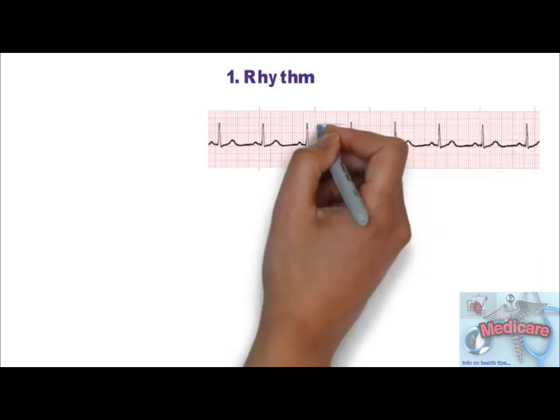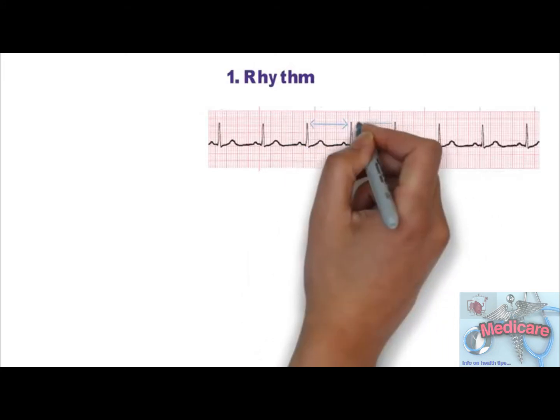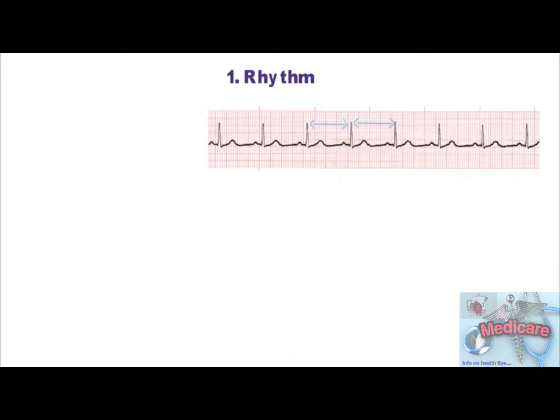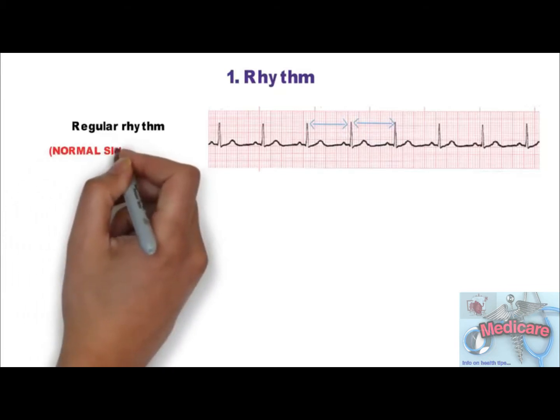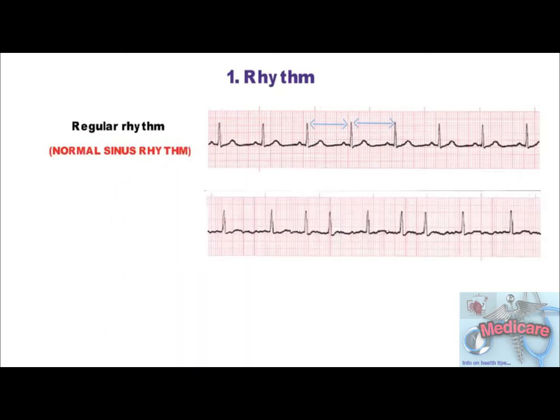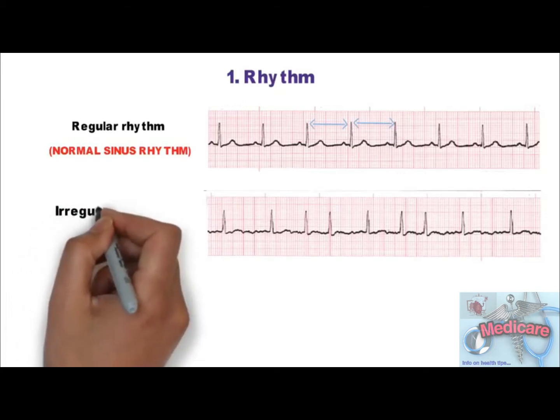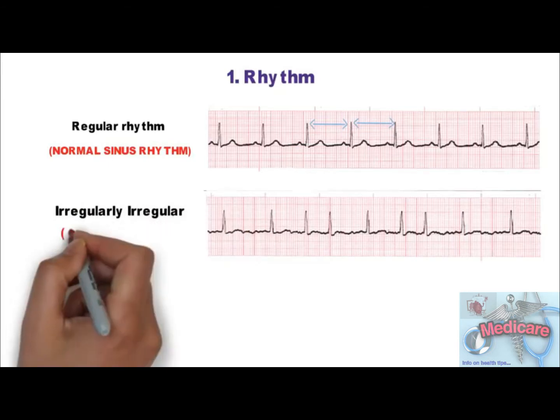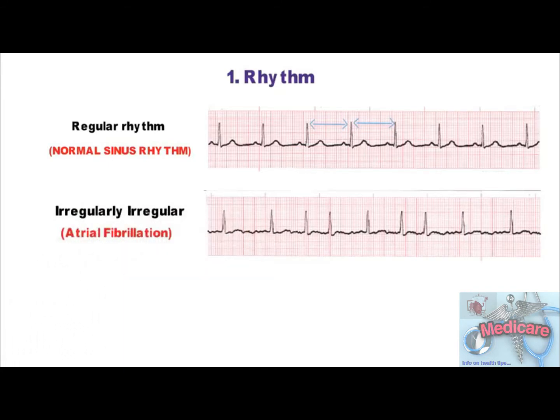To check the rhythm, we check the RR interval. As in this ECG, RR intervals are equal and there is a P-Wave before every QRS complex, so this is a normal sinus rhythm. In this second ECG, the RR interval is not equal at any time and there is no identifiable P-Wave. The rhythm is irregularly irregular, which occurs most commonly in atrial fibrillation.